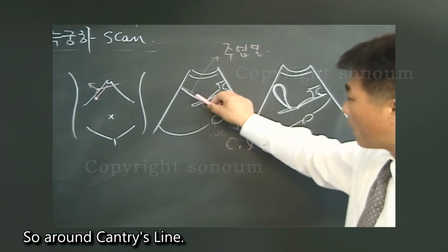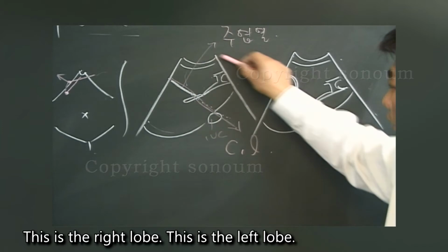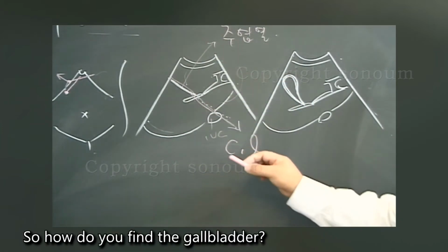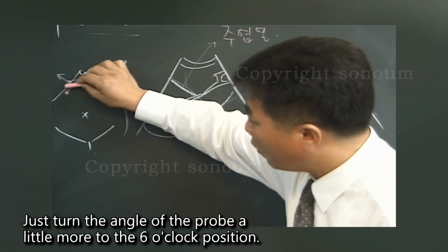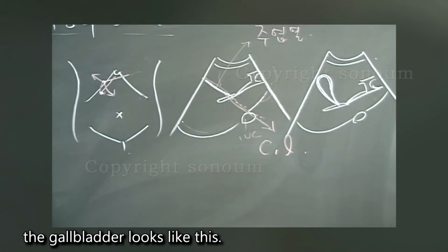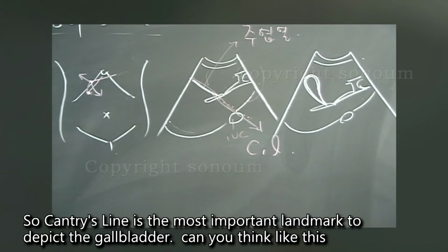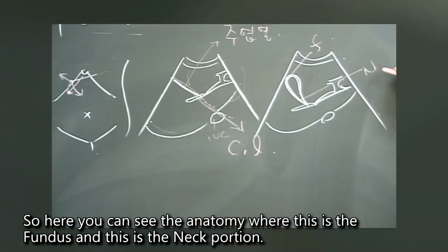So around Cantlie's line, this is the right lobe. This is the left lobe. So how do you find the gallbladder? Where this Cantlie's line is visible, just turn the angle of the probe a little more to the 6 o'clock position. When turned like this, the gallbladder looks like this. So Cantlie's line is the most important landmark to depict the gallbladder. Can you think like this? So here you can see the anatomy where this is the fundus and this is the neck portion.